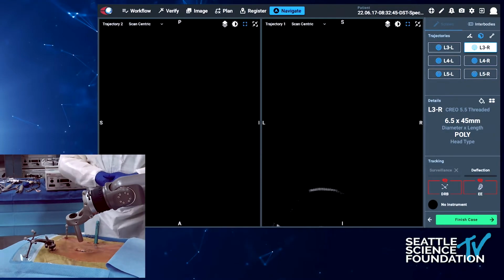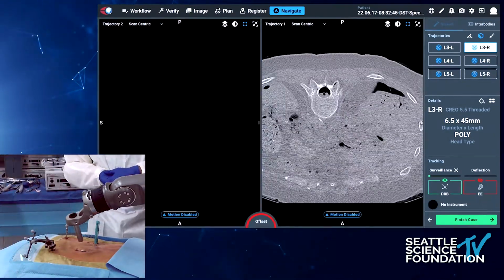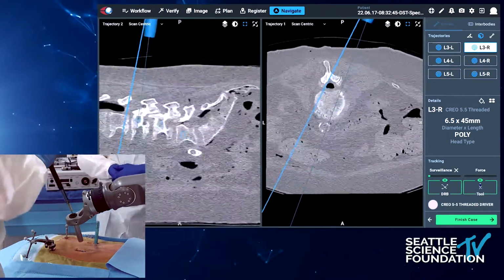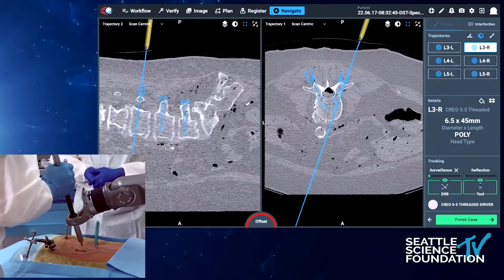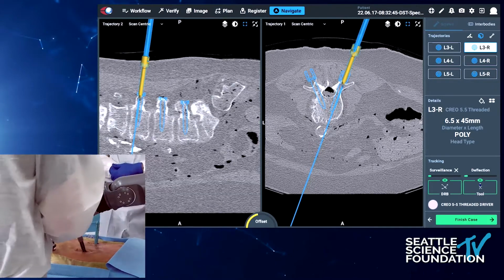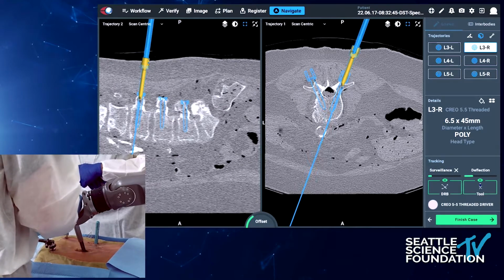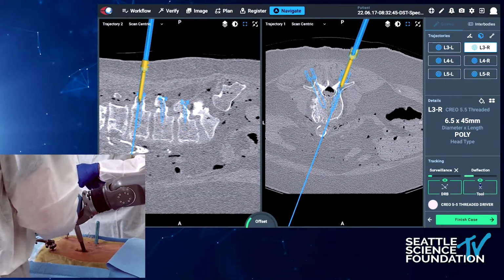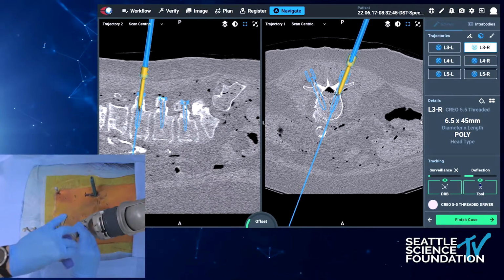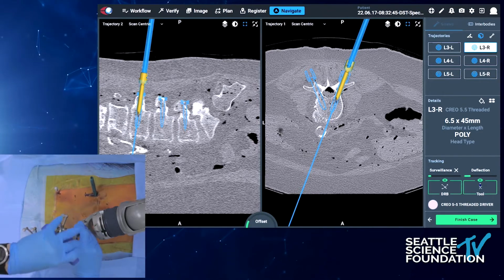Very good. And again, I just redisplay the pedal there. So just hide your instrumentation for one second. Yep. And the goal really is, we have the green there, so you're ready to proceed. As I was saying, the main value of robotics here, of course, is the fact that you have navigation. It is navigation. Robotics is navigation. But it's reducing the cognitive load on the surgeon and physical load on the patient with respect to corridors of access.